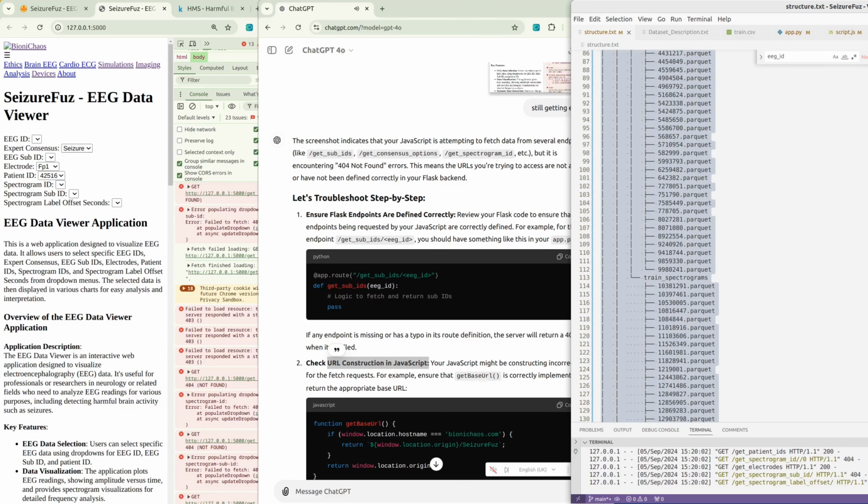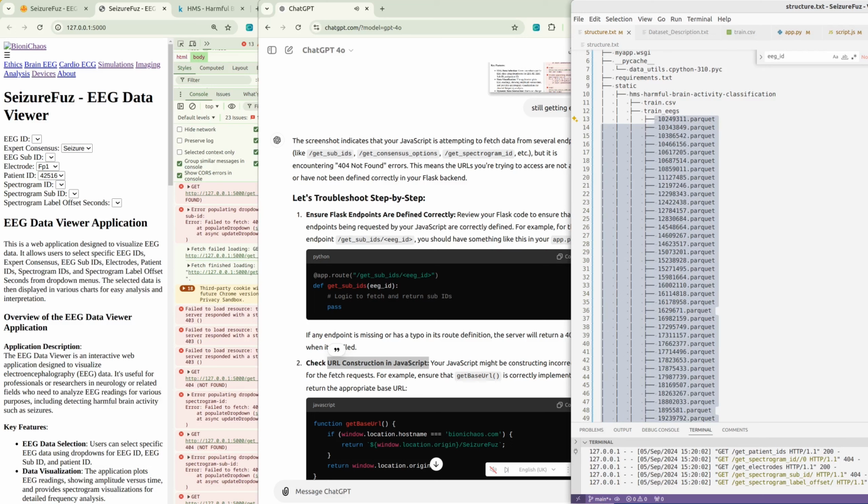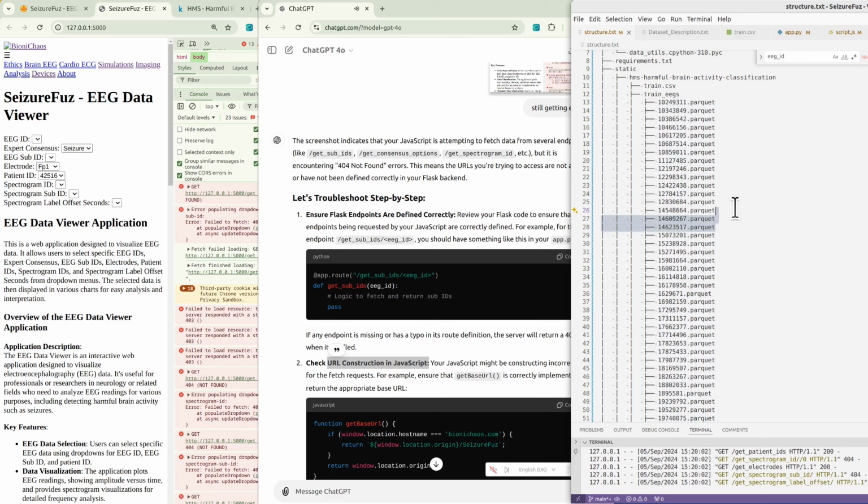6. Dynamic environment awareness. Lastly, we added a little intelligence to the code by letting it know where it's running. A clever function checks if the application is on the production server or a local development machine. Depending on this, it adjusts its behavior accordingly, ensuring that everything runs smoothly no matter where it's deployed.